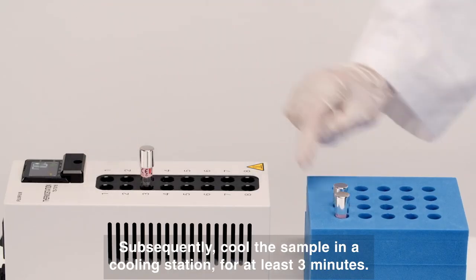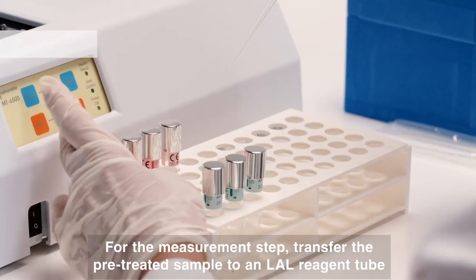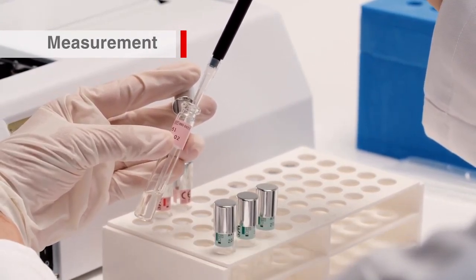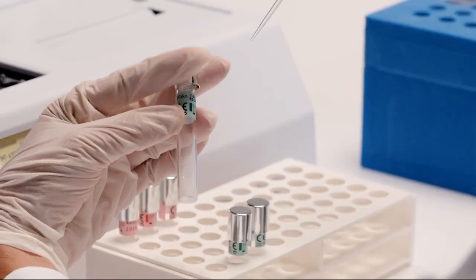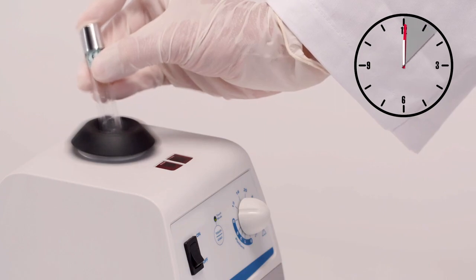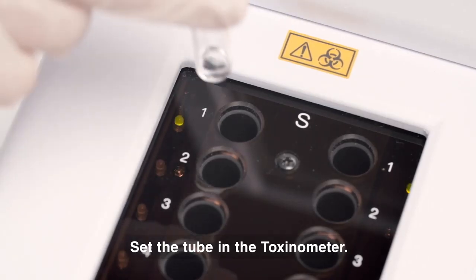Subsequently, cool the sample in a cooling station for at least 3 minutes. For the measurement step, transfer the pre-treated sample to an LAL reagent tube and mix it gently. Please check for air bubbles in the liquid. Set the tube in the toxinometer.